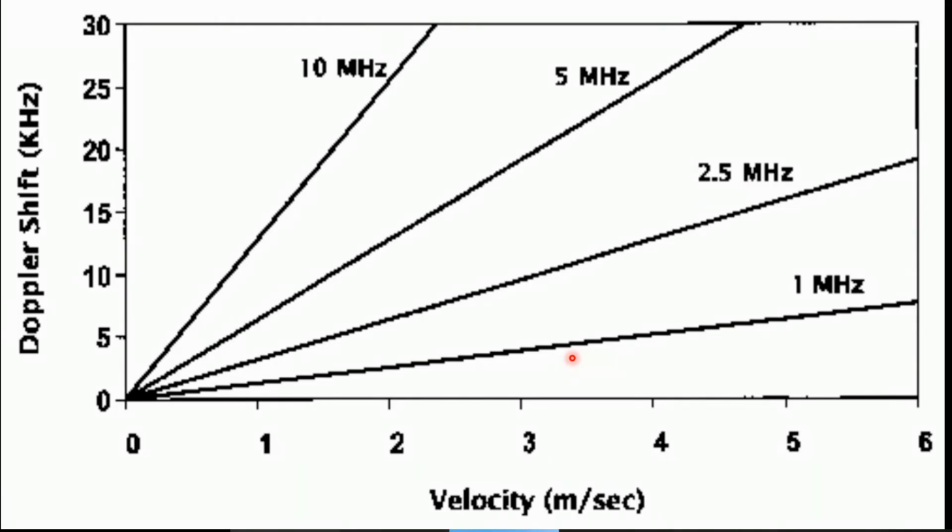This is in contrast with two-dimensional echocardiography, where the resolution is best when the echo beam is perpendicular to the tissue or the blood which we are interrogating. Usually with two-dimensional echocardiography, we are dealing with morphology or anatomical features, whereas when you're dealing with the Doppler effect, we are dealing with physiology.